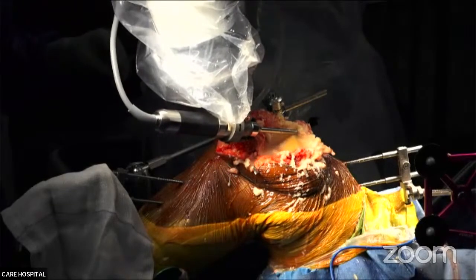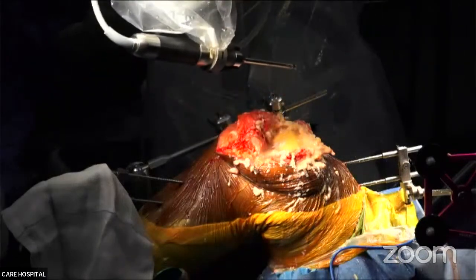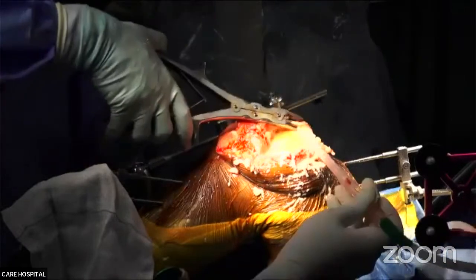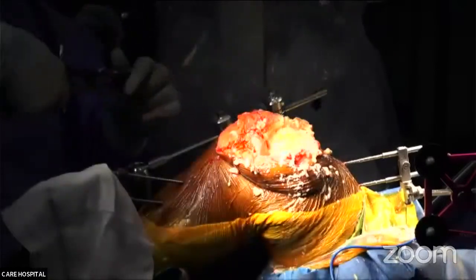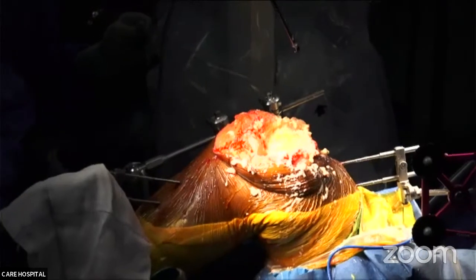So normally it cuts very fast and very smooth. The cuts are really very smooth, and it just spares the outer rim of the bone so as not to invade the soft tissues. The milling system is very smooth.